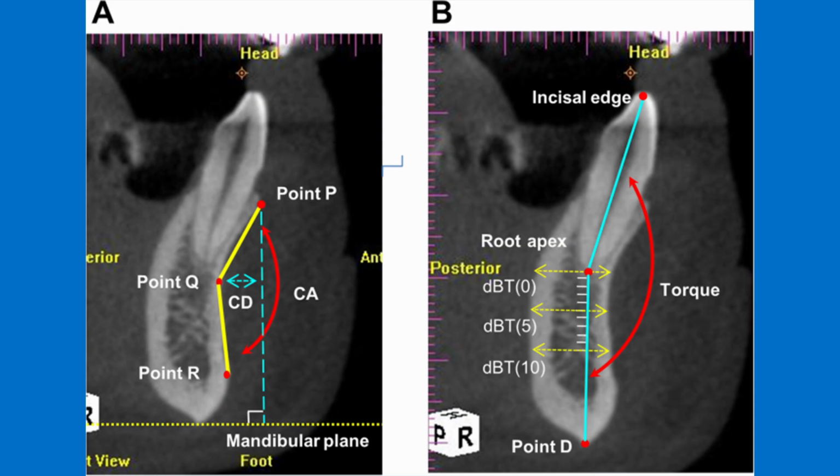When implants are placed immediately after extraction or into extraction sockets, fixture angulation often shifts toward the labial side. This can perforate the lingual bone plate of the mandible, increasing the risk of implant failure. However, patients indicated for AllonX typically already have significant alveolar bone resorption. Therefore, when fixtures are placed according to the shape of the residual bone, it becomes possible to fabricate implant prostheses with screw access holes naturally emerging on the lingual side.